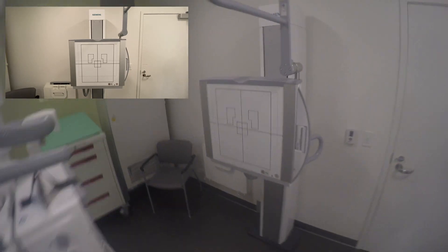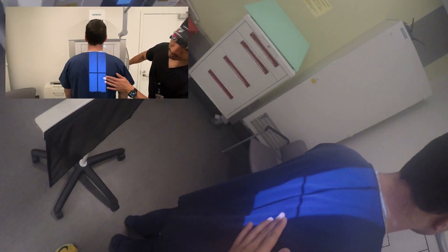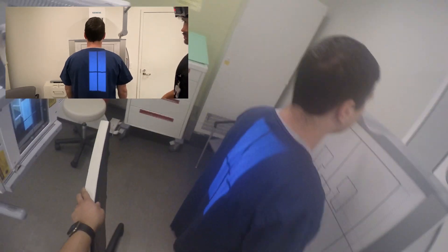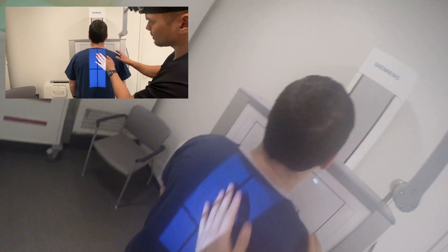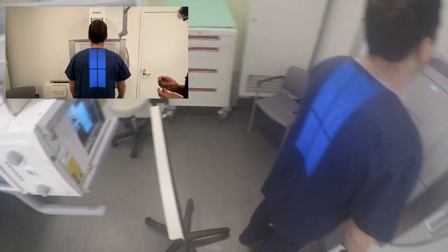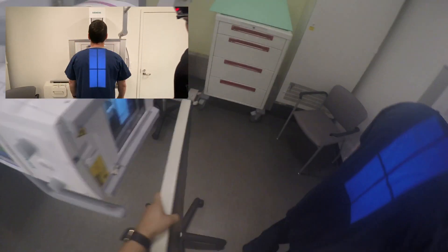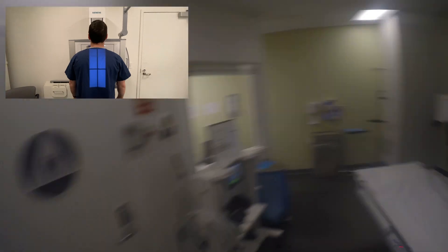I shoot my standing T-spine PA to limit dose to the radiosensitive organs. I have my patient roughly in the area where I want, decrease OID by getting their chest close to the bucky, MSP aligned with the vertical crosshair of the tube. I then align my bucky and tube to the patient's height. To do this, I feel for the inferior angle of the scapula, which is a landmark of T7 where the central ray needs to be centered at. As long as you have your image receptor lengthwise and you're centered at T7, you got it.